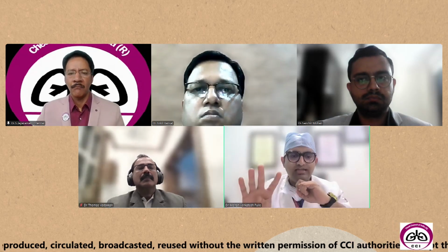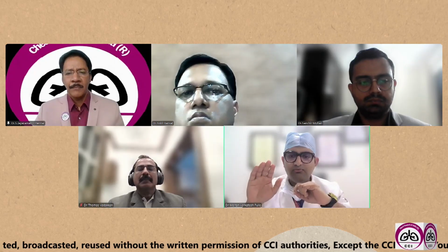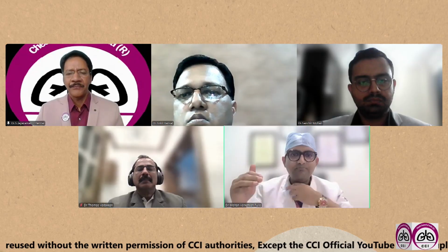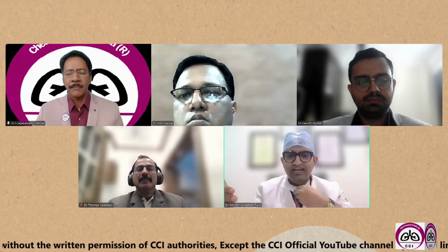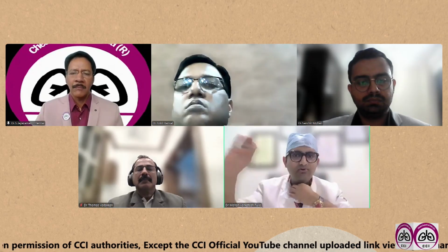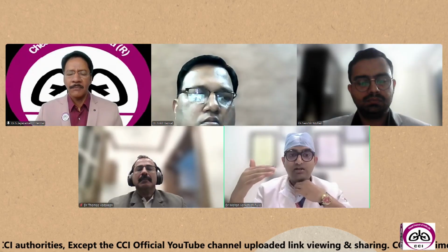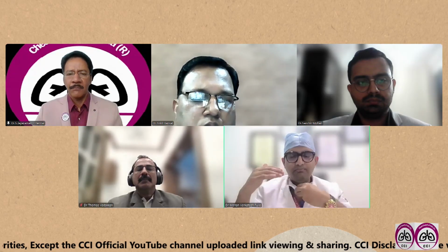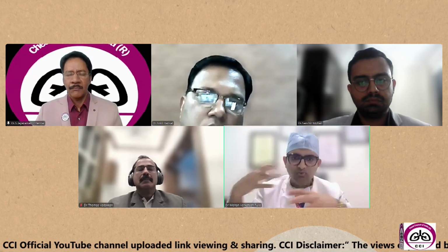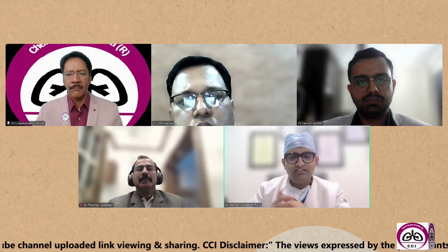And the fourth important thing is if my pulmonology colleague is a fresh pass out and is doing EBUS in his initial stage, because the false negative rates in that situation are there. Technically he may not be able to sample it well, because the false negative rates are up to 15 to 20%. It's a very high price the patient pays if it falsely comes as negative and you do a procedure which should not be done. So these are the 3-4 situations.